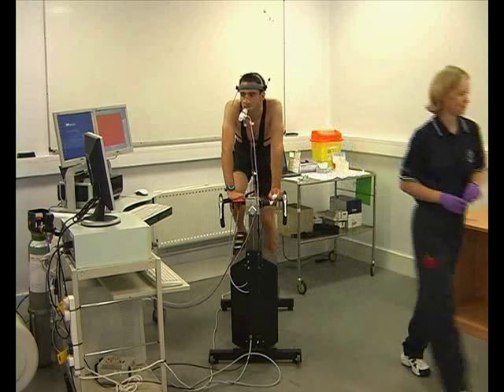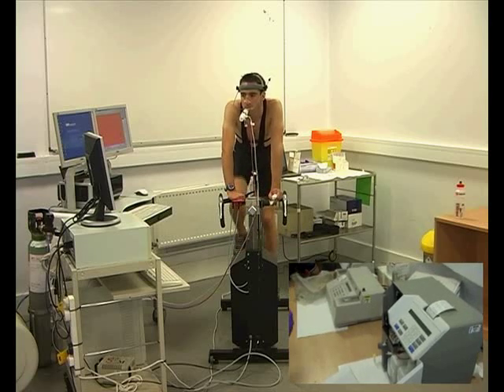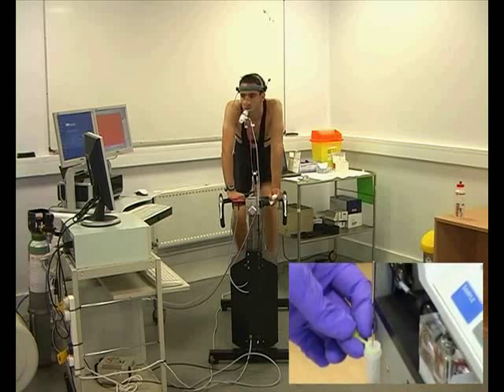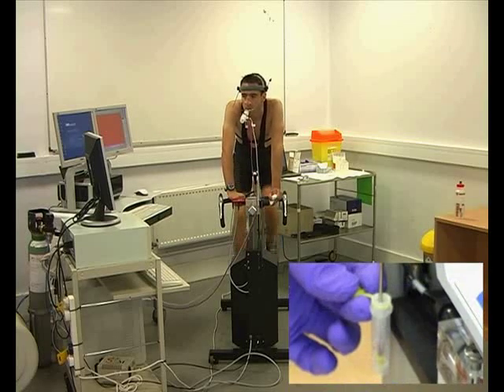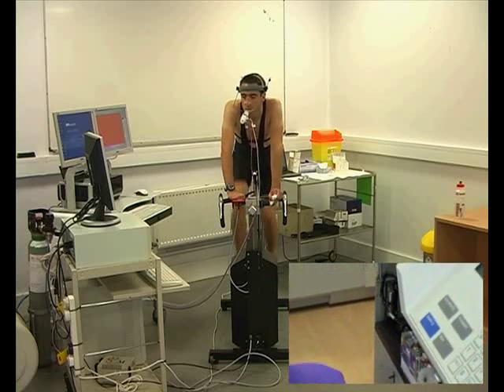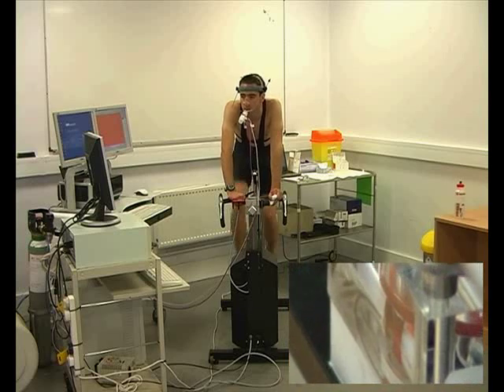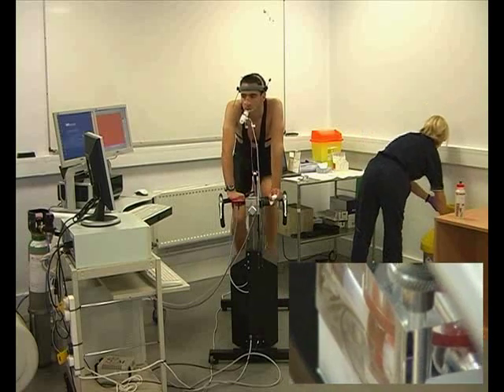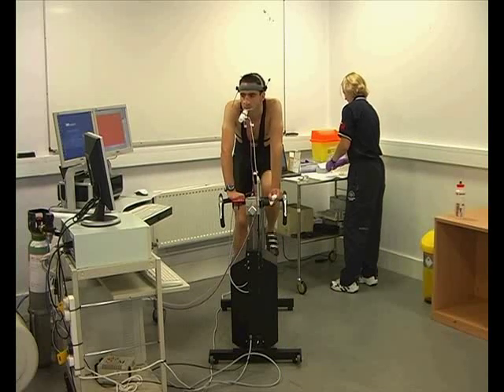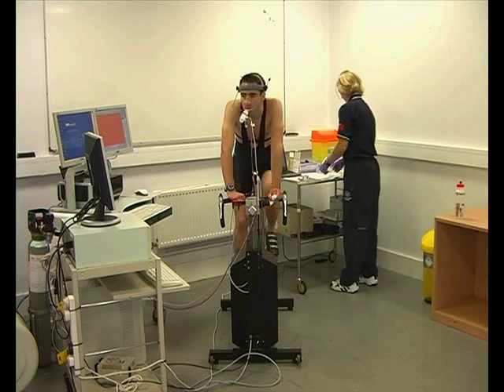After that short delay, it's time to analyse it using our desktop analyzer. We present the tube to the sipper. Make sure the sipper is right to the bottom of the collection tube. Press the button to aspirate and you can see the blood disappearing from the tube up into the sipper. The sample is then collected and flushed into the mixing chamber where the analysis takes place. Once that sample's gone through, it's time to get ready again for the next one.